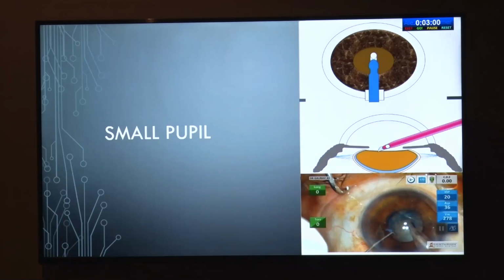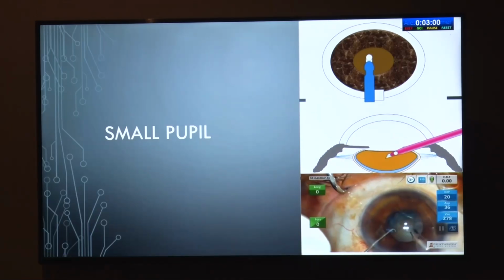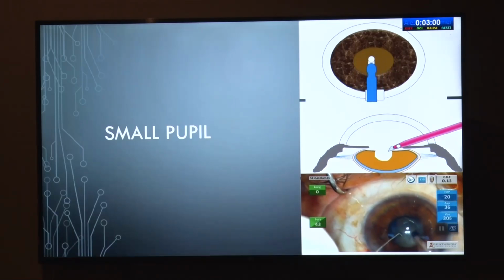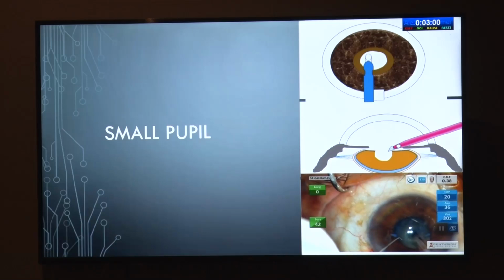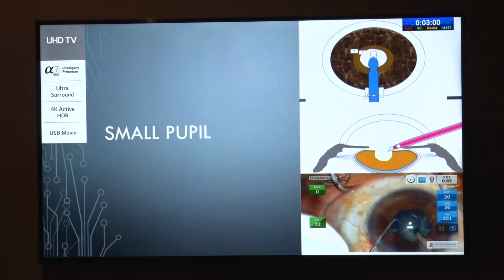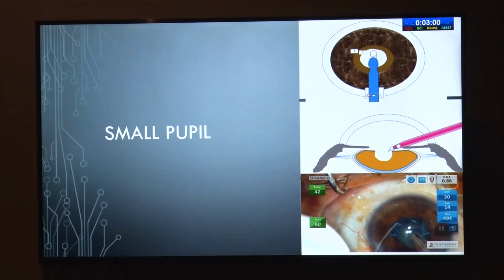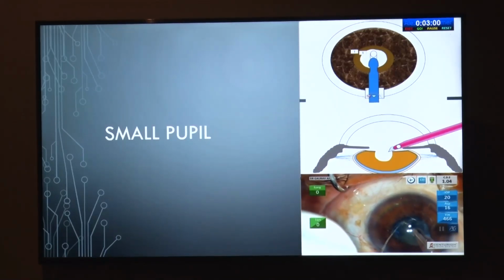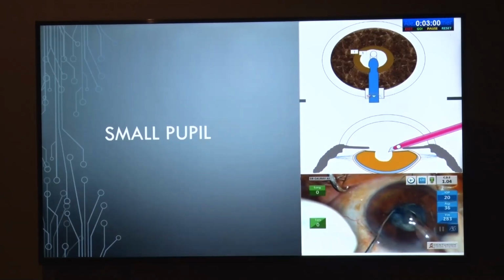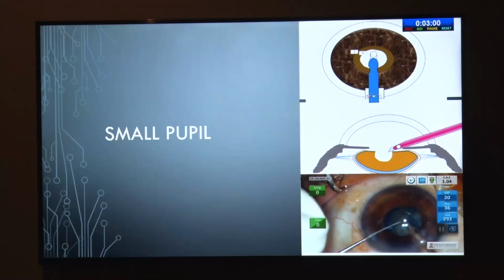Even in small pupils, in this case you can see the pupil is small, not dilating with the intracameral dilators. You have small space to work. You cannot use expanders because of the shallow AC. You have small area to work, but in this case also you can successfully do this maneuver without any complications.